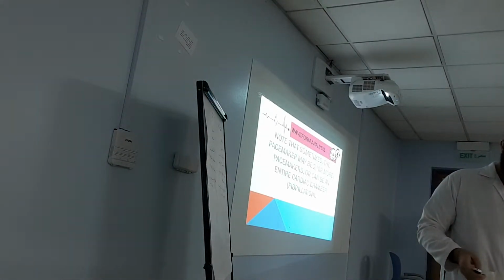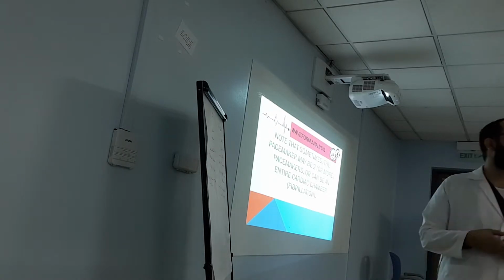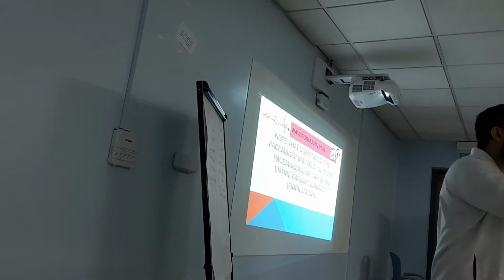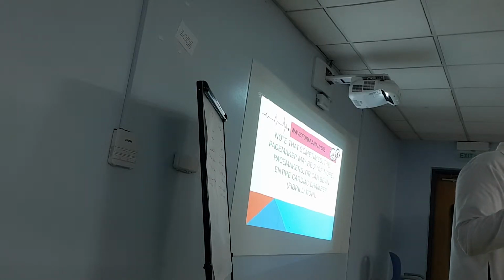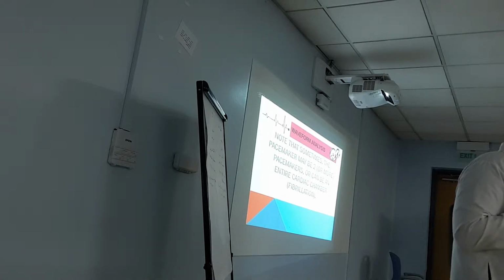Sometimes you have two pacemakers. So you identify the pacemaker. You find another pacemaker. We will learn how the pacemaker initiates the P wave or may not initiate the P wave. So if initiated by the P wave, so probably sinus.